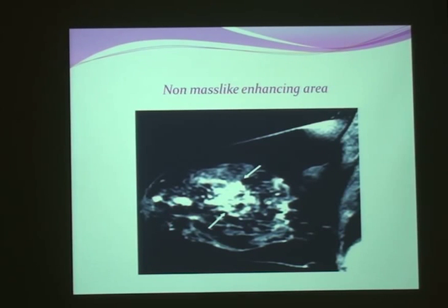And I will return again to say that invasive lobular carcinoma has the characteristic of branching and infiltrating malignant cells throughout the breast. It usually doesn't cause a mass. So we cannot see a mass in the mammography. We cannot see a mass in the ultrasound.